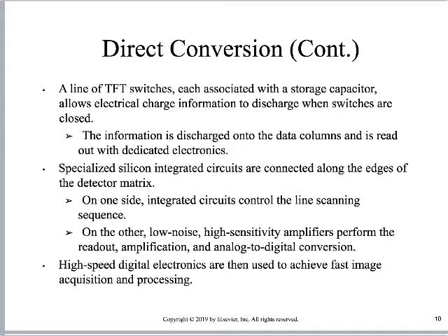What are we going to use those capacitors for in direct capture? They're going to capture our image, and then we're going to discharge them as a way to read that image out. So just think about getting tased, and that's what we're doing. We're discharging those capacitors to release that electricity, and there's a lot of information in that. Just ask anyone who's been tased how much information's in there.